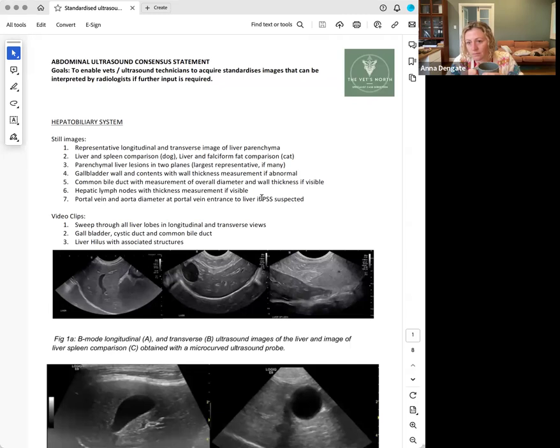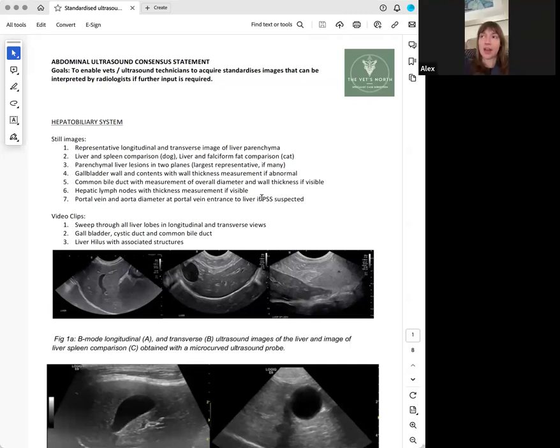And then I fan up the left side. And as I'm fanning up the left side and going all the way up to the edge, I'm looking at the caudal margins. And also I feel like to assess echo texture in liver, the movement is so important. I find that still images don't always represent really subtle, nodular heterogeneous changes. So if I'm at all worried about the liver or there's liver enzymes, that's the point that I'll take a video, when I'm fanning up.